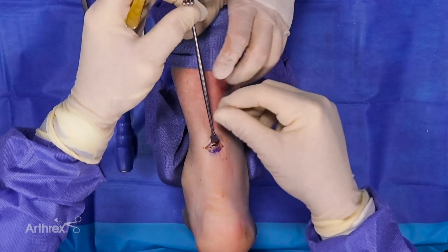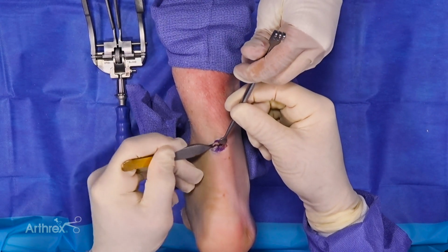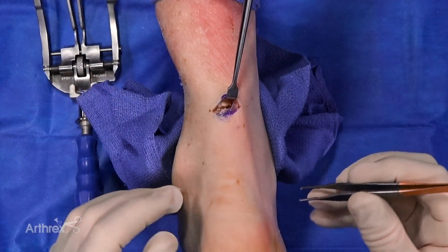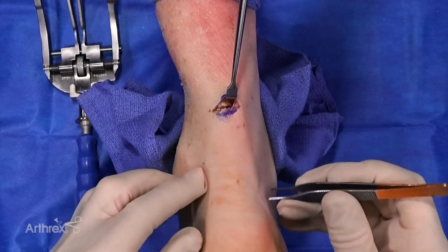So for the purpose of this demonstration, I've already created a complete rupture of the Achilles tendon at this classic location, approximately 6 centimeters above the insertion of the calcaneus. We first addressed the proximal side, and so we're going to go ahead and use our PARS on the proximal side, place our sutures, and then address the distal side.